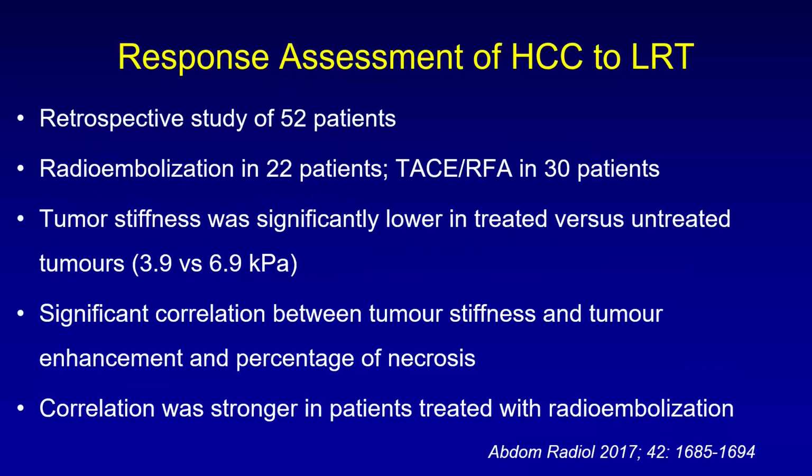This is a retrospective study of 52 patients for response assessment of HCC to locoregional therapy. 22 patients had radioembolization and 30 patients had TACE or RFA. Tumor stiffness was significantly lower in the treated versus the untreated tumors. There was a significant correlation between tumor stiffness and tumor enhancement and percentage of necrosis. The correlation was stronger in patients treated with radioembolization.